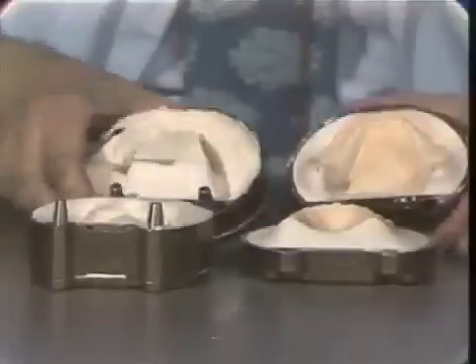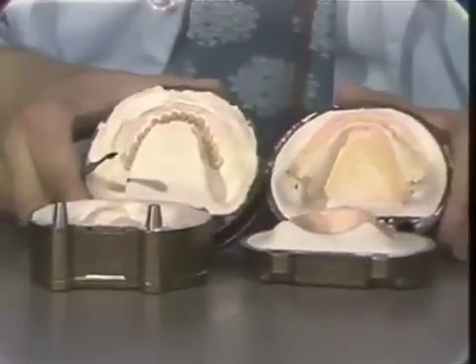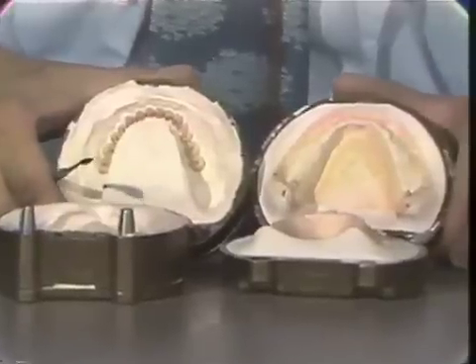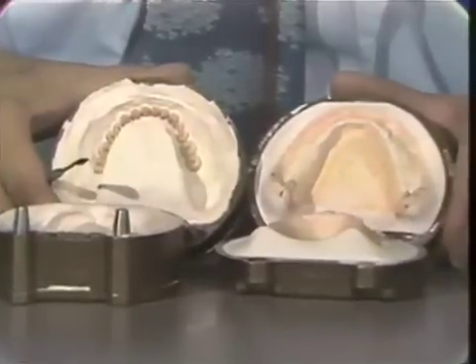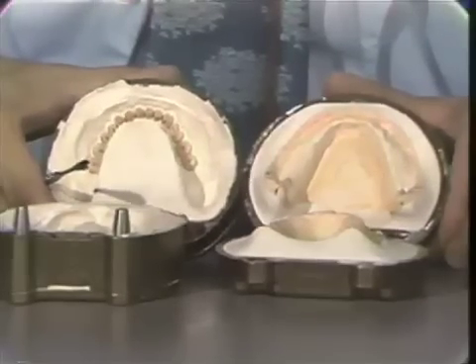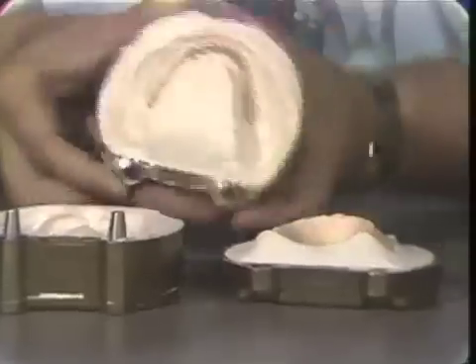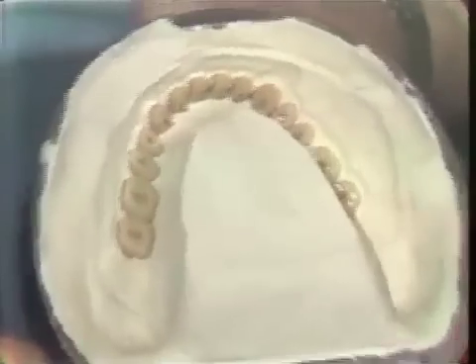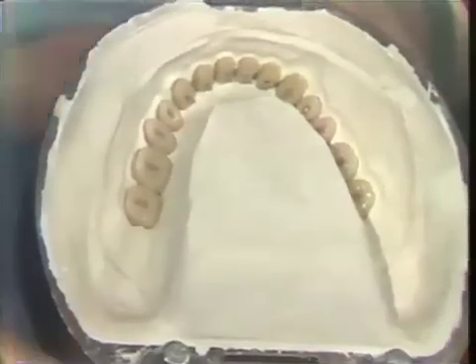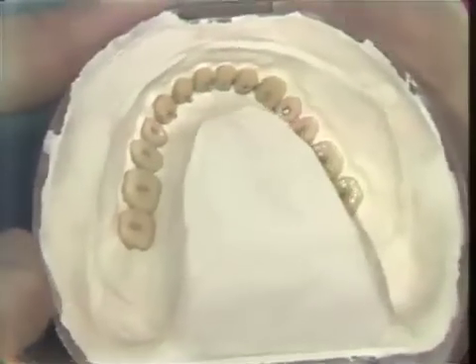Now you may see the mandibular flask. The master cast does not look any different than it did when you originally poured it. It has all the exact contours that you were so careful to preserve, and the top of the flask now contains the teeth. And you can see the gingival contours. At this point, we are done with the boil-out, and we are ready to proceed with packing the denture.